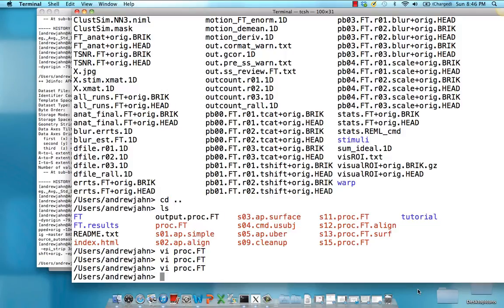Having just covered slice time correction, we're now ready to move on to the step of volume registration. Volume registration refers to aligning all of the volumes within the functional runs to a base reference volume. This base volume does not move — it's stationary and arbitrary, but we select one to be a stationary reference image. Throughout all the acquisitions, the subject is never perfectly still; they can translate their head in the X, Y, and Z directions, or rotate it in roll, pitch, and yaw around those axes.